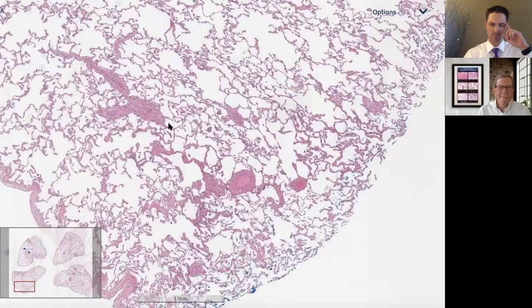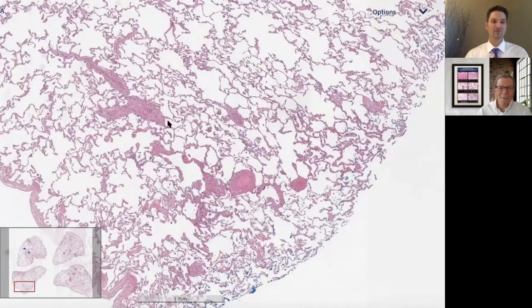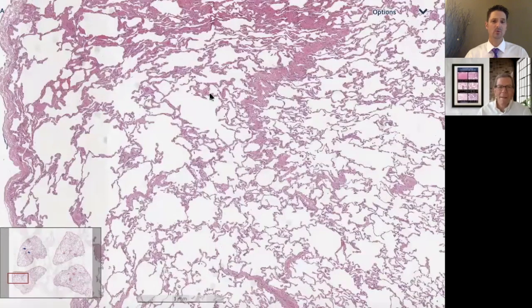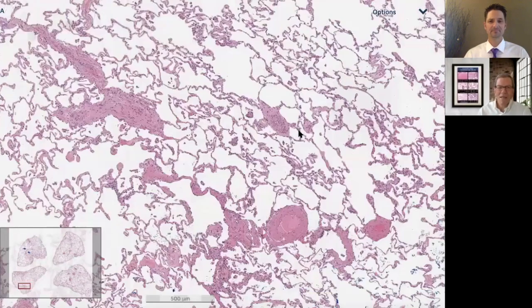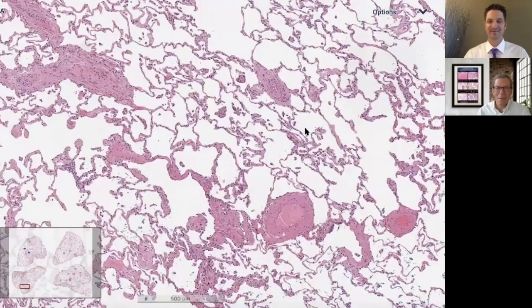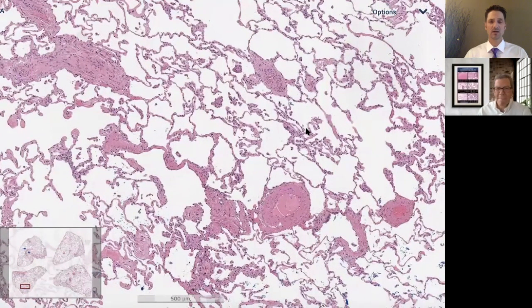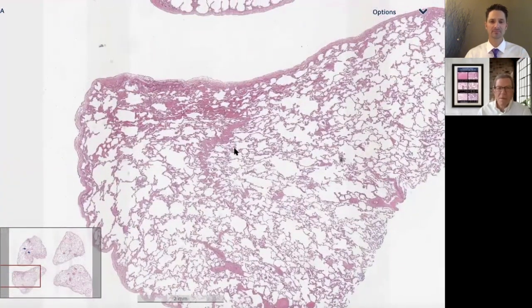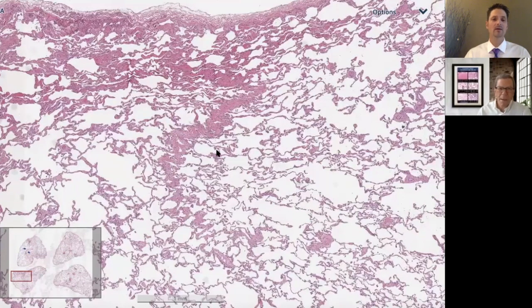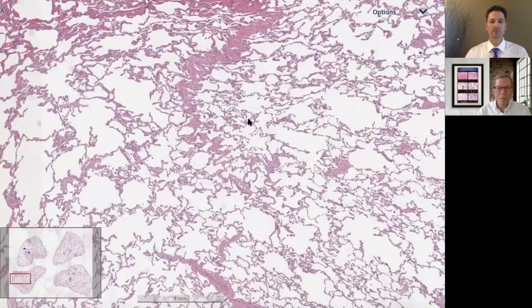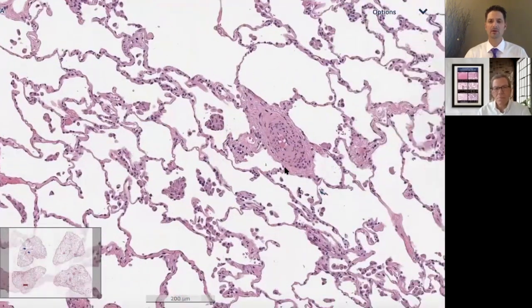One of the issues with this case is that we're seeing a lot of vascular structures, which in our minds we think of as pulmonary arteries. But actually these are intralobular post-capillary venules that we're seeing very prominently throughout this biopsy. I think this is one of the first clues when starting this analysis — we have a whole bunch of cross sections through vascular structures out within the lobule that we typically don't normally see. This is an invisible compartment until it has disease — completely invisible normally.